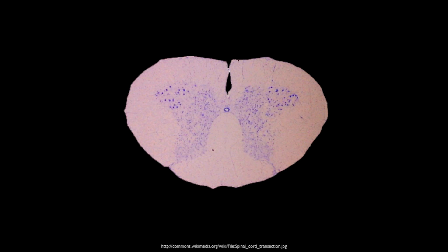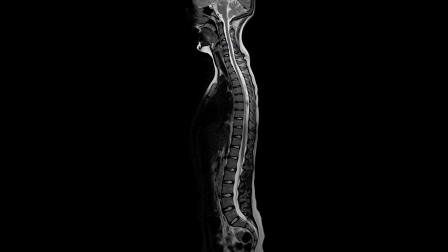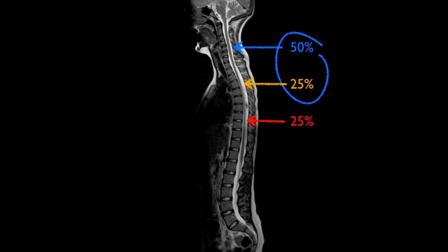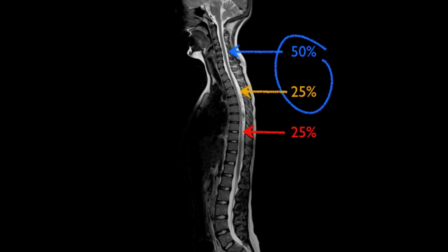Ependymomas of the spinal cord arise from the central canal, which is lined by ependymal cells. Their distribution along the cord is not even, with the majority being present within the cervical cord, and only a quarter being located within the thoracic cord. An additional quarter spans the cervicothoracic junction, and as such approximately three quarters of ependymomas are located in the upper cord.